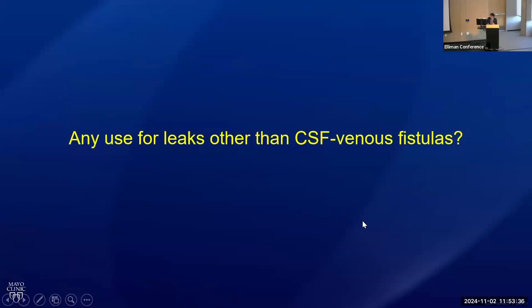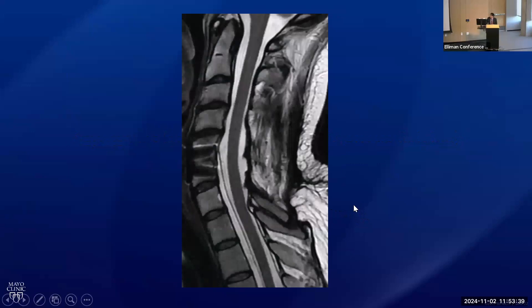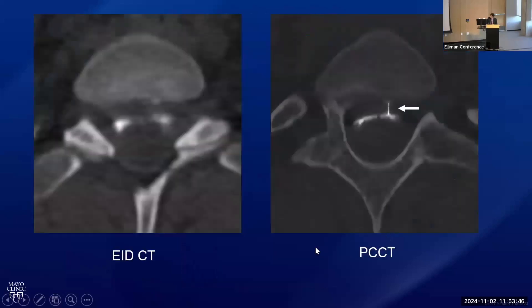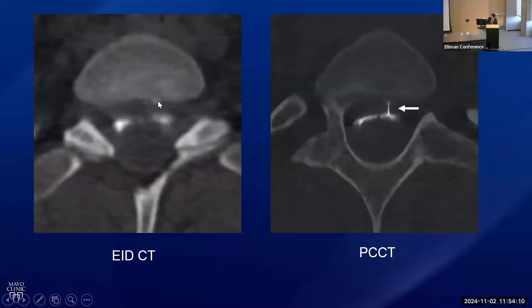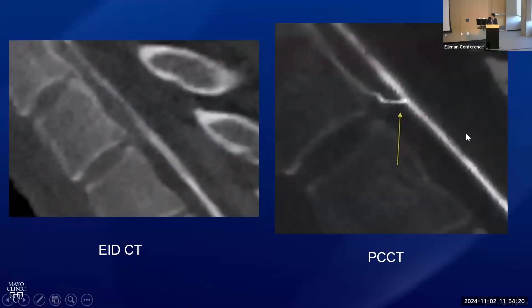Can you use photon counting CT for leaks other than fistulas? Certainly. Here's a patient with a large extensive epidural fluid collection — we know they have a dural tear somewhere, just a matter of finding it. We initially did a prone dynamic CT myelogram using our EID scanner and didn't really see anything. There was a lot of contrast at the spot where the leak ended up being, but we couldn't get anything to leak into the epidural space. When we repeated that on photon counting CT, we saw a thin jet of contrast compatible with a ventral dural tear. On the sagittal image you can nicely see the leak on photon counting CT.